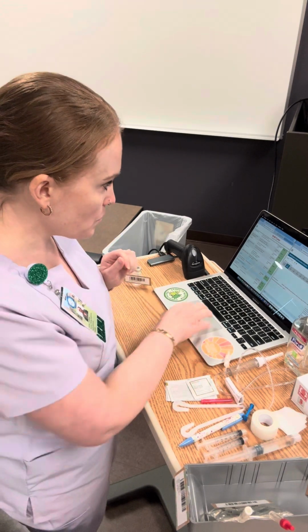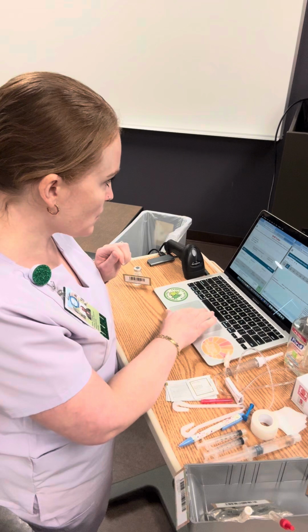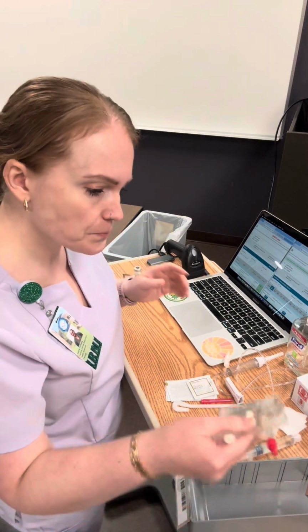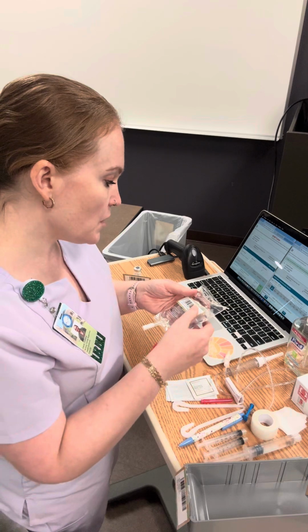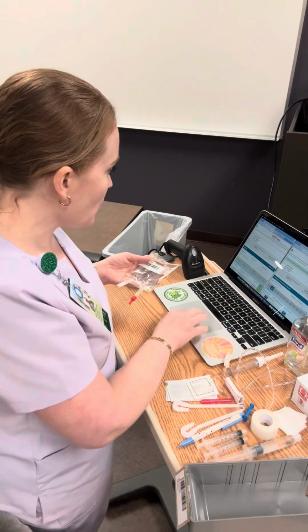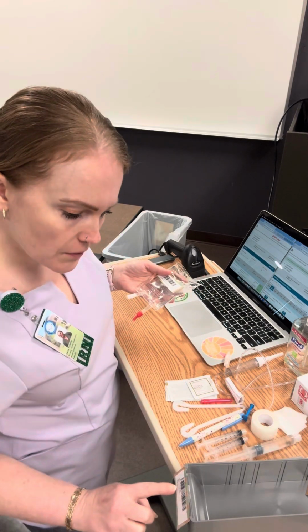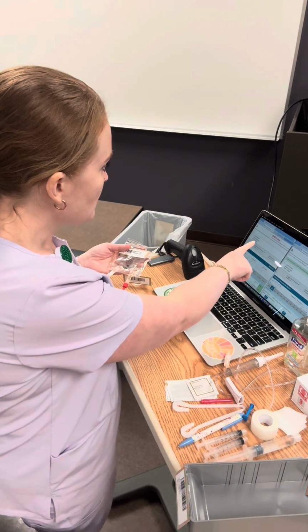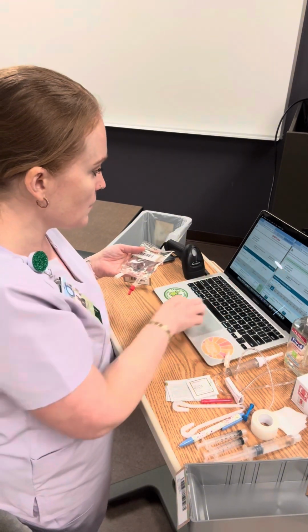I'm going to do the same thing here for MedCheck 1 with my IV piggyback medication, which is meropenem. I will ensure that I still have the right client, Code Brown 61851.